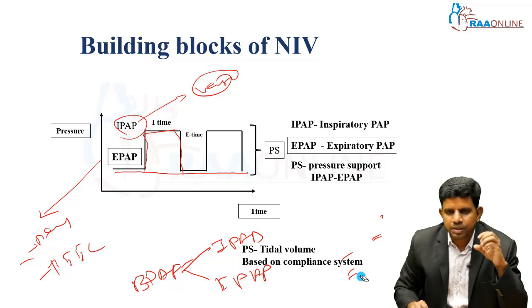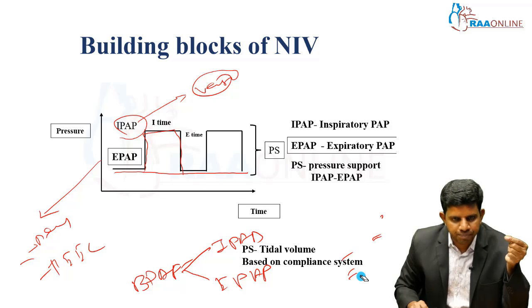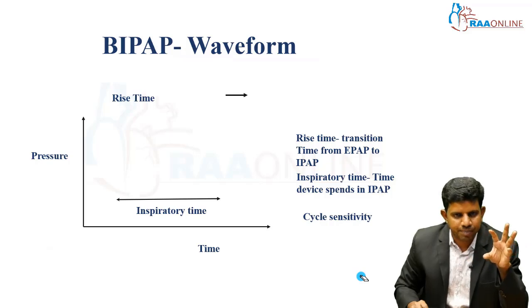The tidal volume depends upon a few things. The most important is my pressure support. If I want to increase my tidal volume, I have to increase my IPAP. It's very important. Other things you should know are the basic waveforms of our BiPAP.